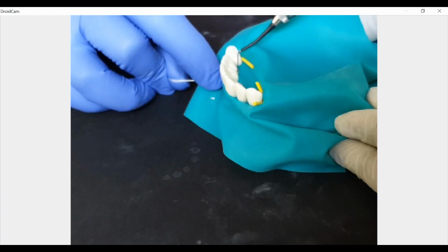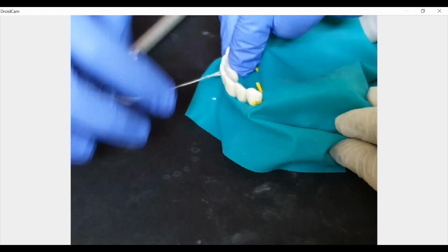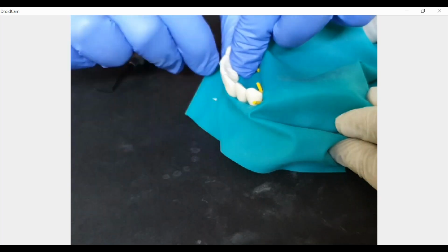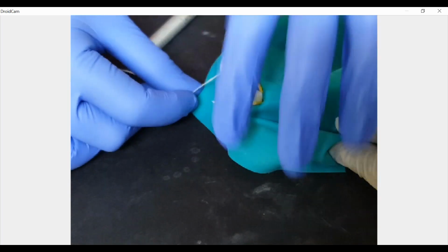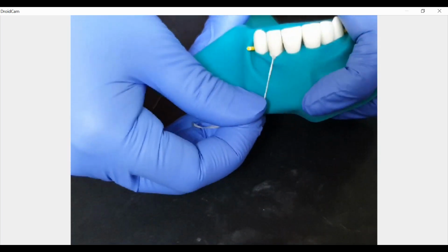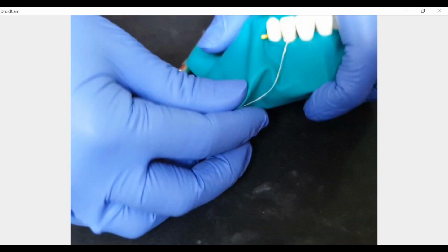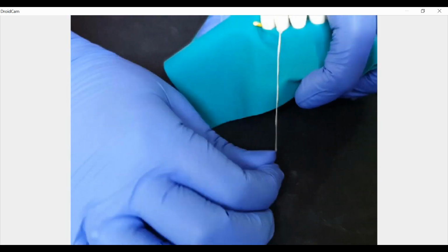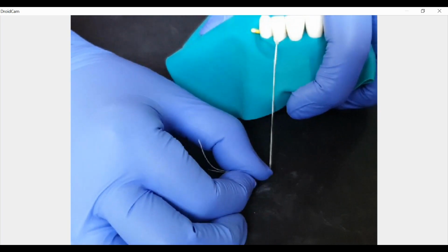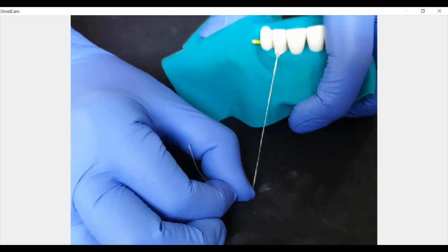Once I've come here, I don't have to do much. I have reached the cingulum on the other side, then I will just tighten it from this side and my isolation with floss tie will be complete. So you see what I did here is I have just tightened the noose and my isolation is complete. If I want retraction, then I will attach my floss tie to my rubber dam frame on top, and that will help me in further retraction or further pulling. This is particularly useful if you are doing a veneer cementation, etc.